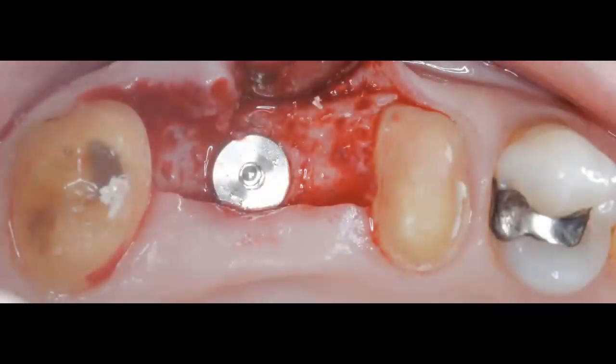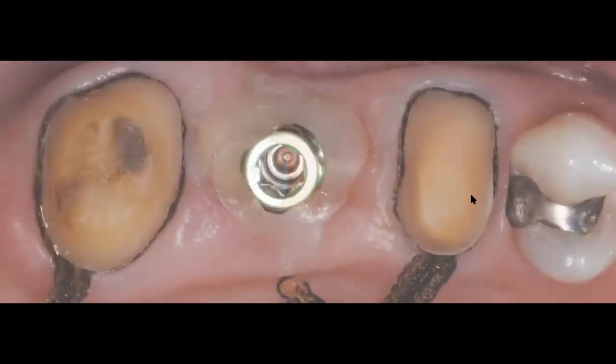And here's my implant right after implant placement. You can see that I'm dead center between the molar and the premolar. And this is all following that initial surgical guide that I created using the actual fixed dental prosthesis temporary that I had fabricated for my patient. So again, another valuable tip that you can use in your practice.